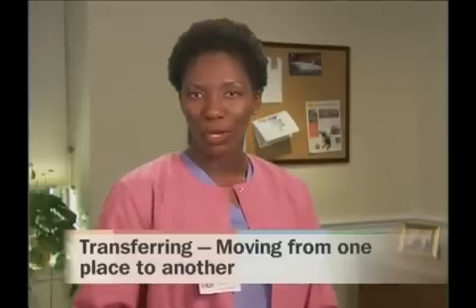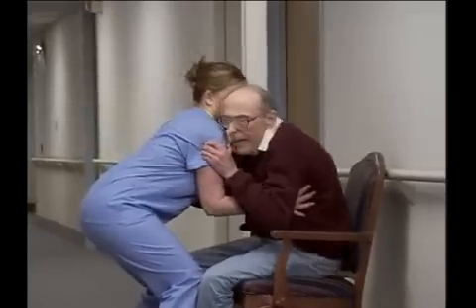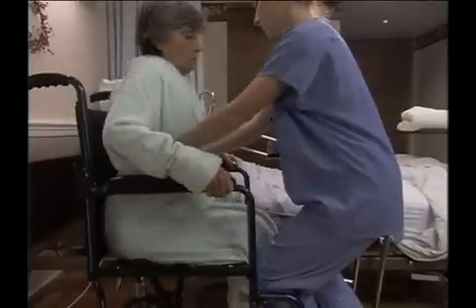As a nursing assistant, you will frequently assist patients or residents with transferring, that is, moving from one place to another. For example, those in your care may need to transfer from the bed to a wheelchair and back again, or between a wheelchair and a dining chair or commode. During transfers, you will need to keep your patients or residents safe, while at the same time protecting yourself against injury. By developing competence in assisting with transfers, and by practicing good body mechanics, you increase the chance that everyone will come through the procedure safely.